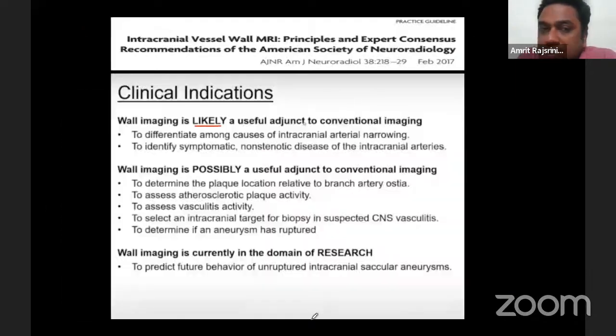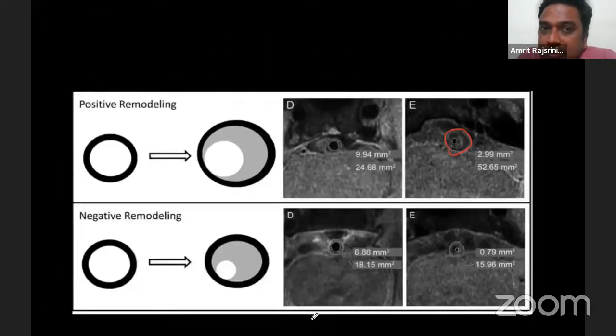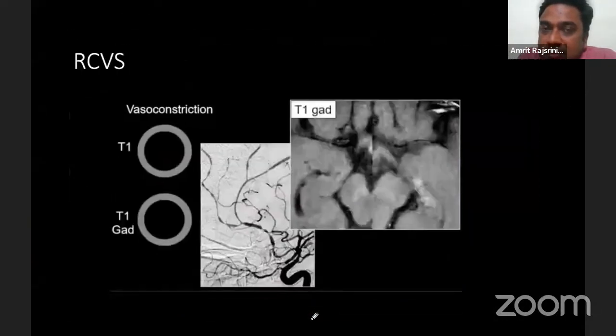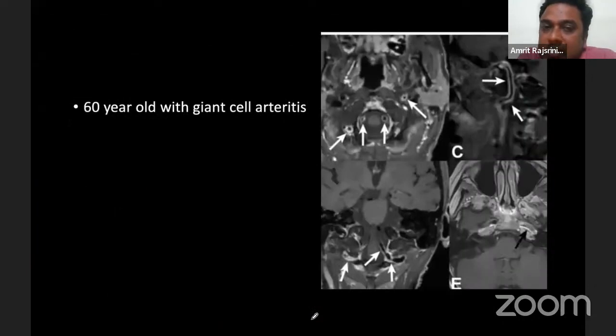Many a times I've seen the radiologists also comment on the ICA, which is extracranial, and even the proximal intracranial ICA can have vasa vasorum, and that can potentially enhance. So these areas where you're showing can potentially have vasa vasorum. Yes, sir. So of course, clinical features and everything will help in diagnosing. But just to be careful, as you had mentioned in your presentation, the extracranial vessels have vasa vasorum, intracranial don't, but proximal intracranial vessels can still have vasa vasorum.